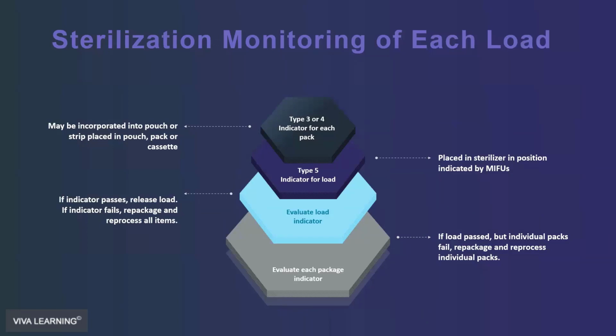Oh, another very good question. Am I saying we don't need to use a date stamp for sterilization anymore? No, that's not what I'm saying. And thank you for asking that question. What I meant was that you don't date stamp your pouches because they have an expiration date. You date your pouches in case there is an incident.